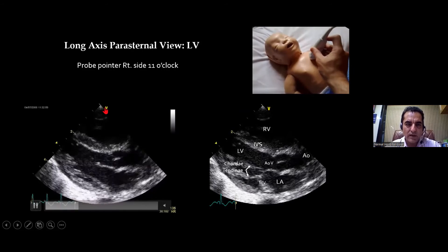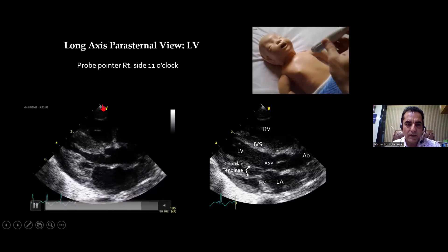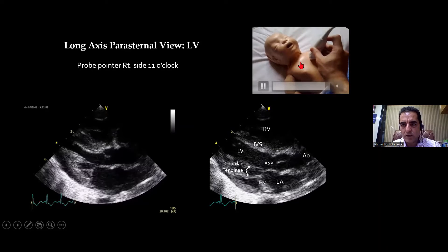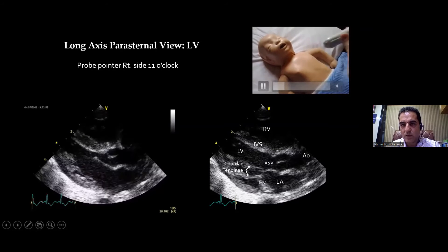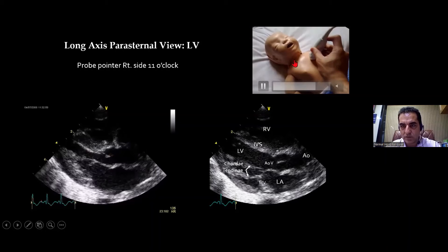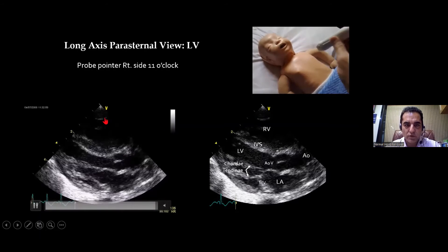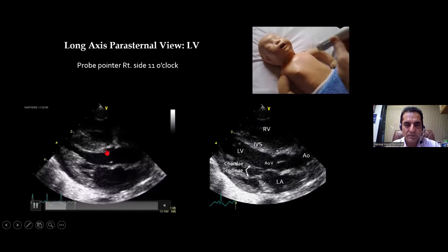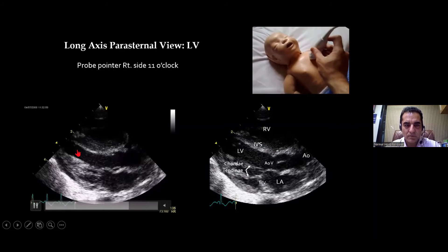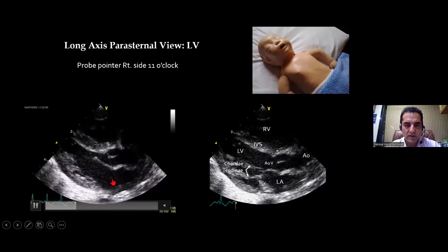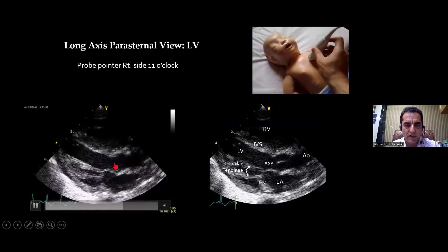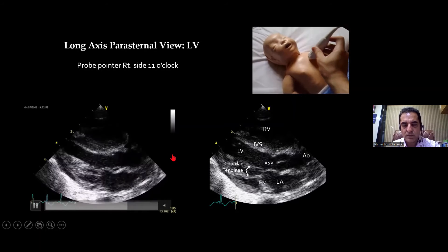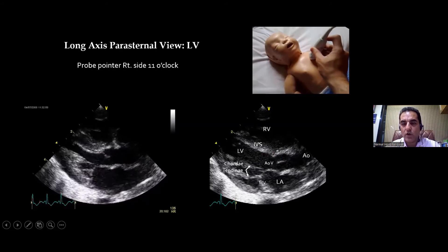Now the marker is up here. The heart is being cut longitudinally because it's a parasternal long axis view. Here you will see the anterior wall of the right ventricle, right ventricle cavity, interventricular septum, left ventricle, left atrium, mitral valve, aorta, and aortic valve.